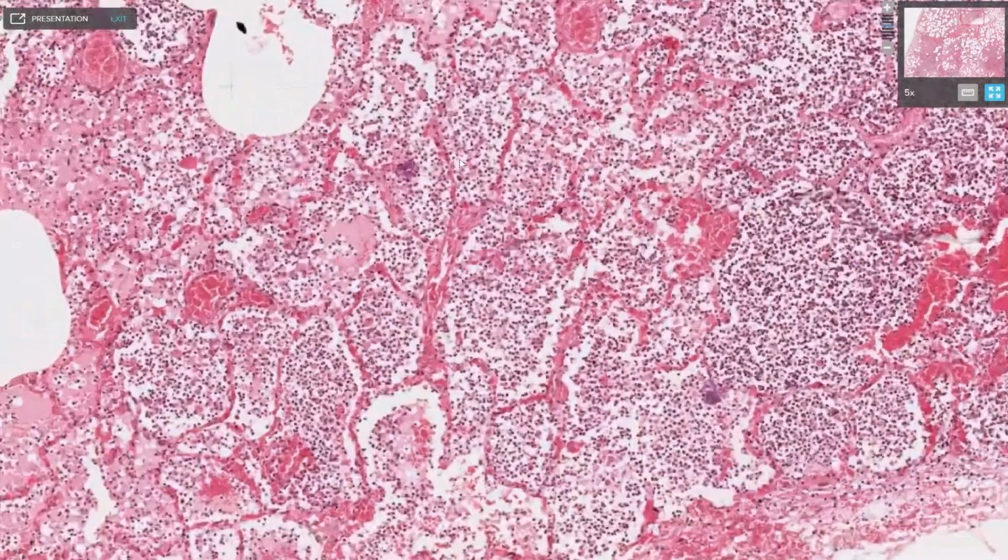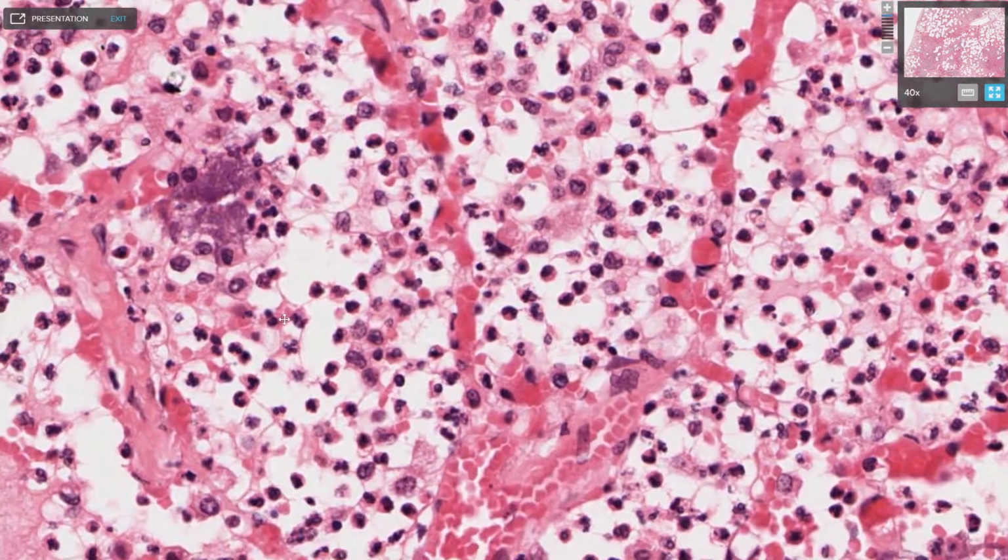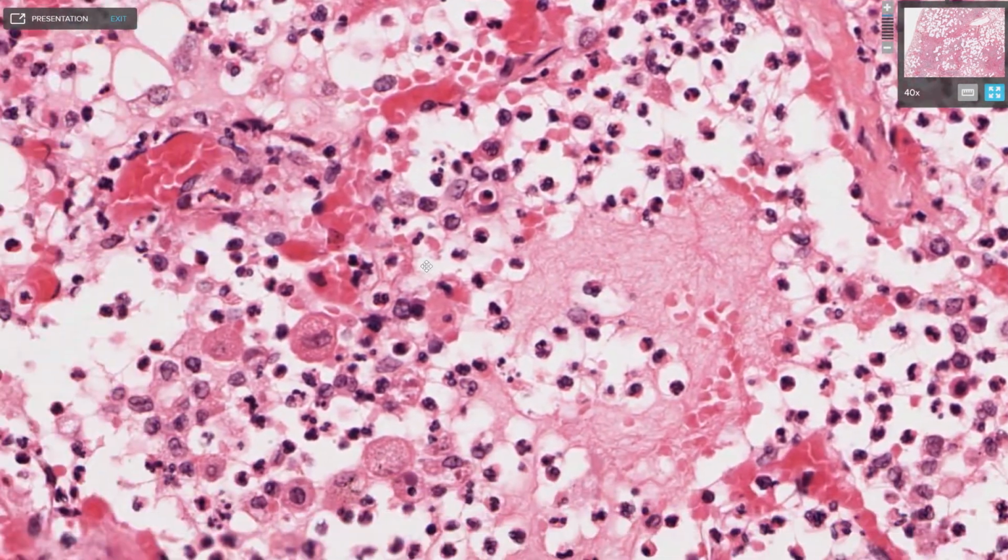I always say, pathology is a very visual discipline. To really understand pathology, you have to see what's going on. And there are two ways of doing that. One is looking at a specimen, for example, with the naked eye, macroscopically. But to really understand what's going on, you need to look at what happens at a microscopic level. So you need to look at a microscopic tissue section, or what we call a histological tissue section.